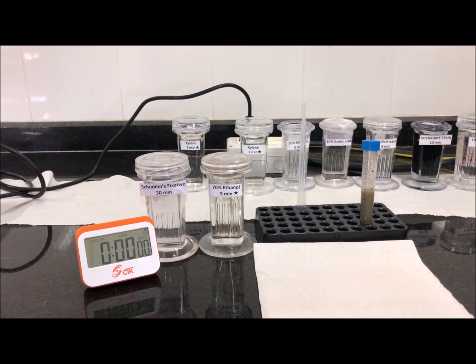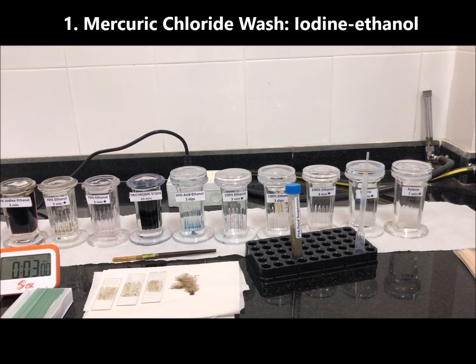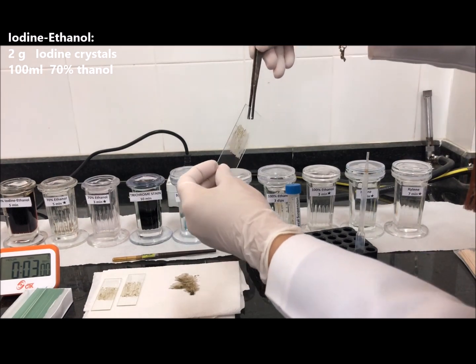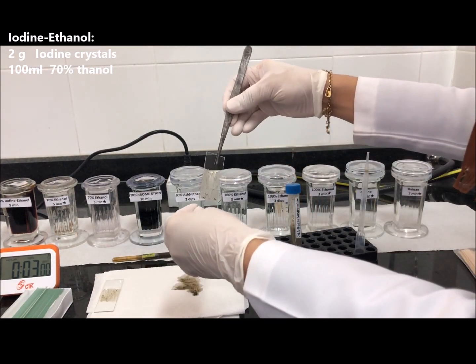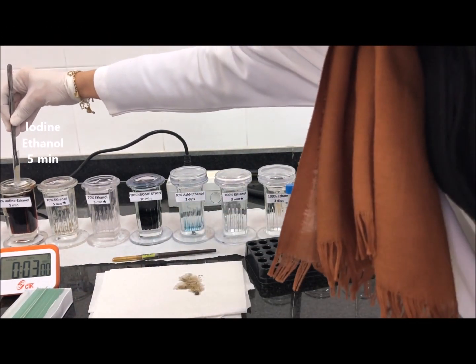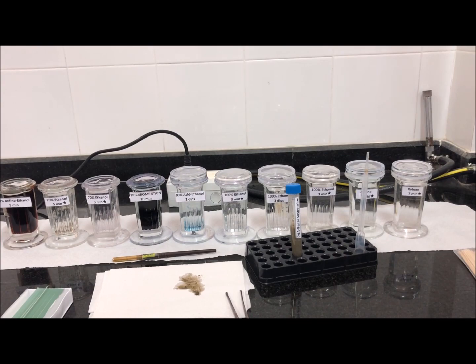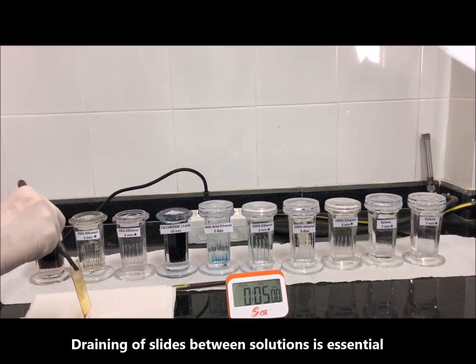After fixing with Schaudinn's fixative and washing with 70% ethanol, go directly to the trichrome stain step — that is, skip the iodine-ethanol step as well as the two successive 70% ethanol steps. For PVA-fixed smears, start the trichrome staining procedure by placing the fecal smear in 70% iodine-ethanol for five minutes. The smears should be dry — at least one hour in an incubator or overnight. The aim of this step is to remove mercury chloride; if not removed, mercury chloride crystals will appear in your smear at the end.